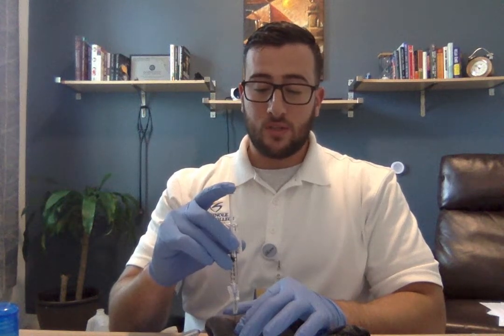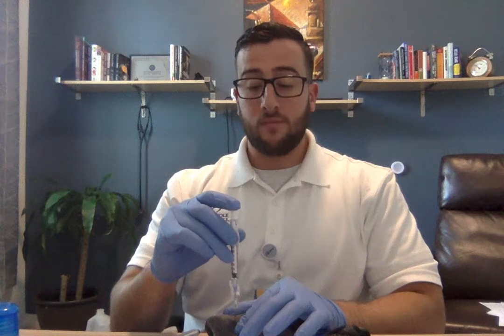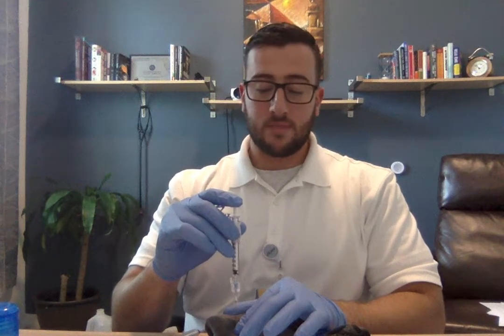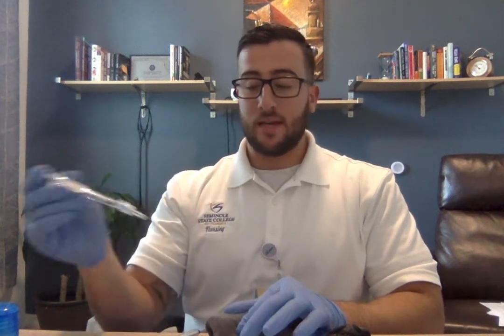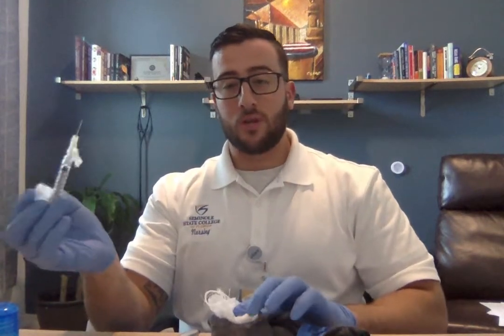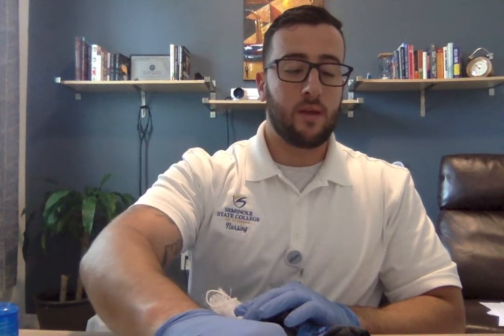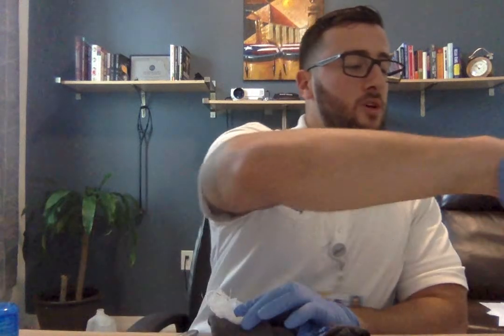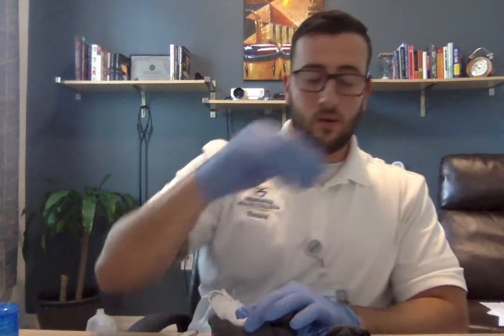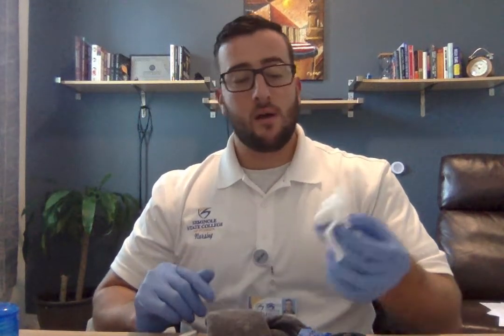I'm going to administer the medication slowly, holding it in for roughly 5 seconds. Then I'm going to take it out and put a piece of gauze on there with a little bit of pressure. While I do that, I'm going to recap my syringe and put it in the sharps disposal. Once I did that, I'm going to hold this for a couple more seconds, then take it off.